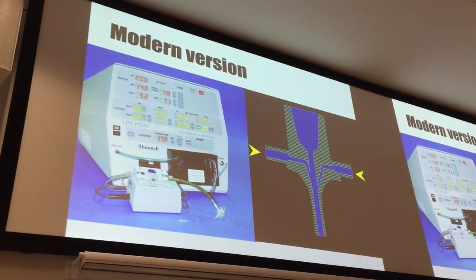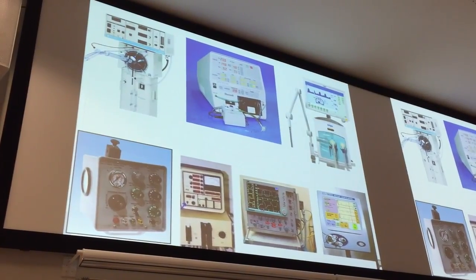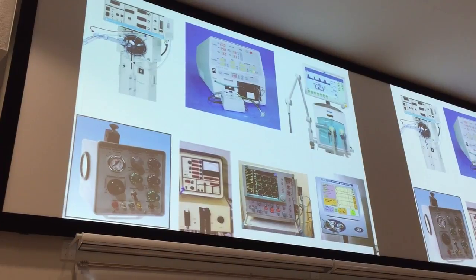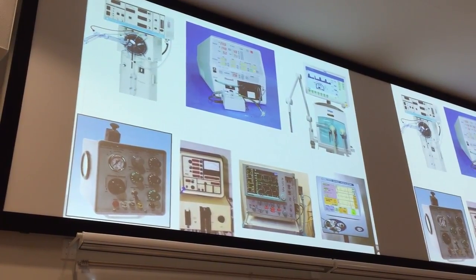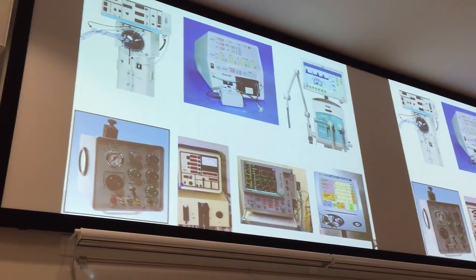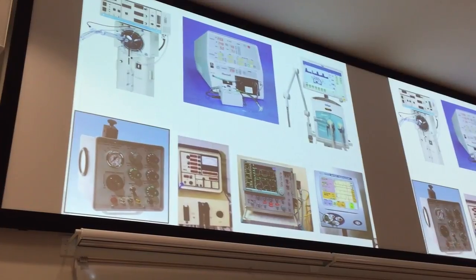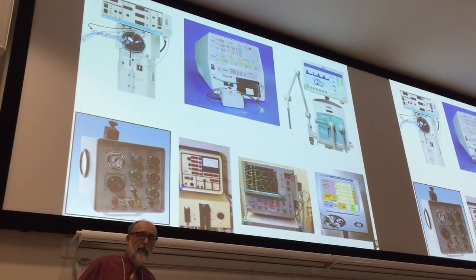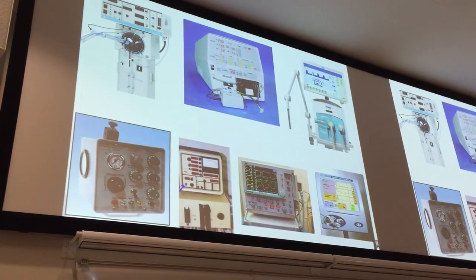There are lots of benefits that you already heard about from Evan and Greg. So we have lots of different devices at our disposal. Some of them are only high frequency devices, those two. Others can do both conventional and high frequency. There are some advantages to that. It's nice not to have to change machines, just change modalities. On the other hand, it makes people prone to change too frequently.